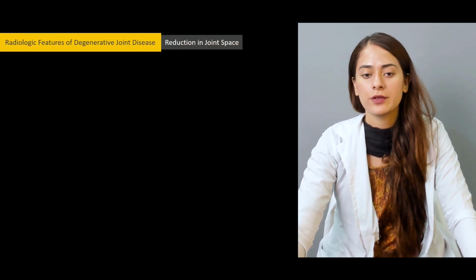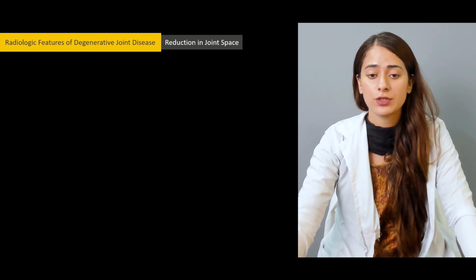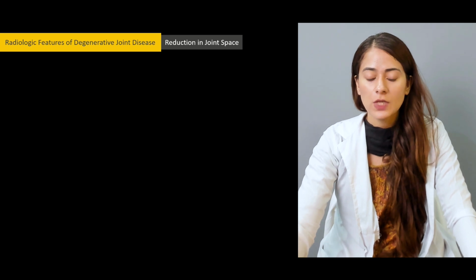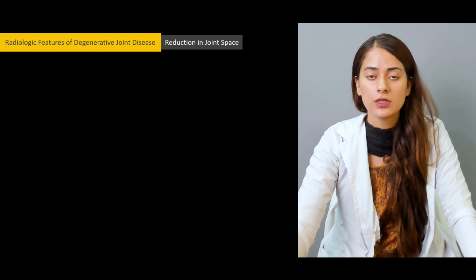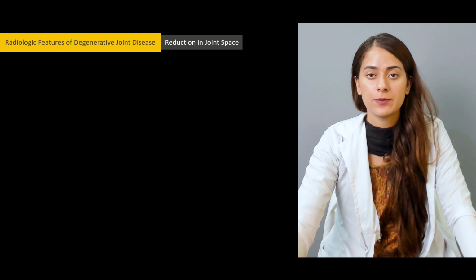Now we're going to talk about the fourth and last section of our lecture, which is radiological features of degenerative joint disease. A lot of changes occur when there is degeneration within the joint capsule. We're going to talk about them step by step.